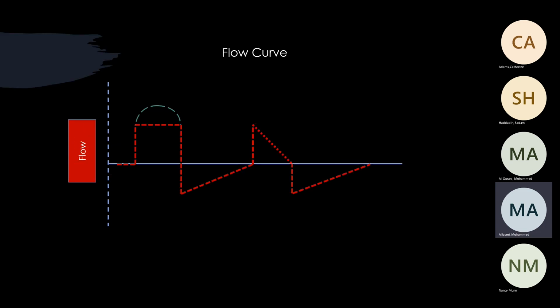Then we talked about the flow. We said if we are volume controlled, then the flow is fixed, and that's what we control. And if it's pressure controlled, the flow is variable. The patient can play with the flow. In volume control, usually we have two different flow patterns: square or decelerating. However, in some new machines you can see sinusoidal, or even accelerating flow. We don't use it. The common ones we use are the square and the decelerating waveform.